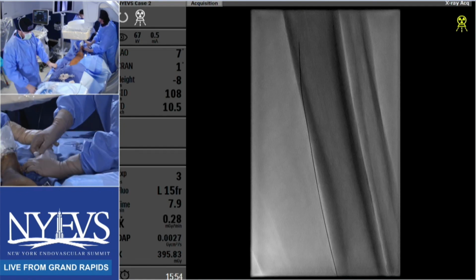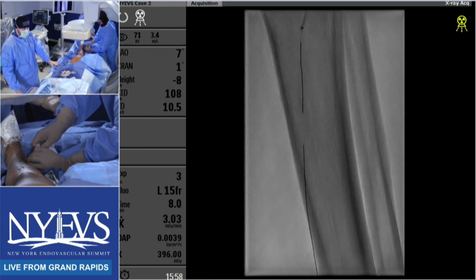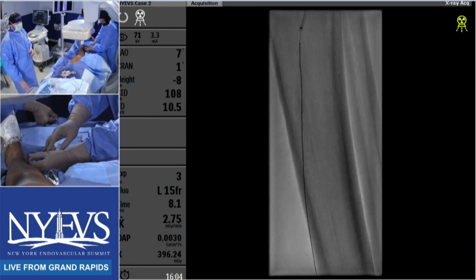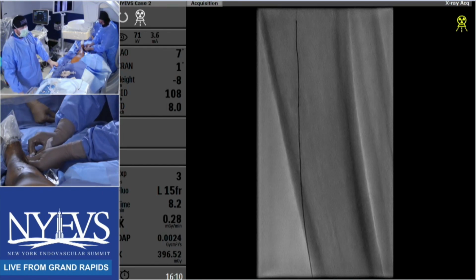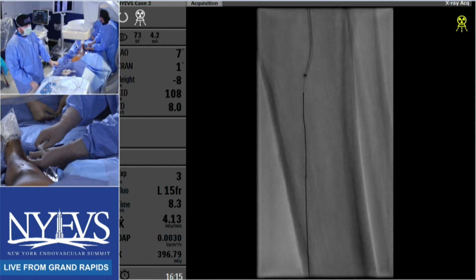The other comment, when you're doing these cases and trying that antegrade approach, sometimes when you don't have the CKD issues, you can get enough retrograde flow or collateral flow to have an understanding of where you're going. But here, you don't want to keep shooting contrast. So switching to retro is smart, and putting your IVUS catheter down is really helpful. But if you can't advance it, like you said, don't push it. That's the biggest thing that people will tend to do.